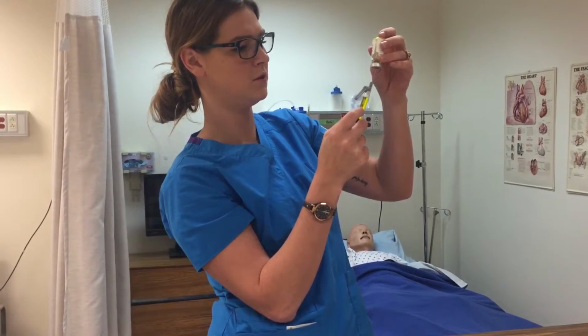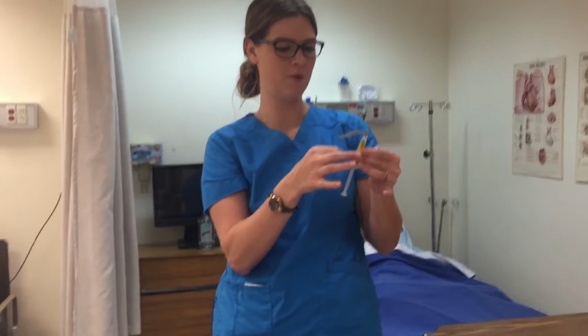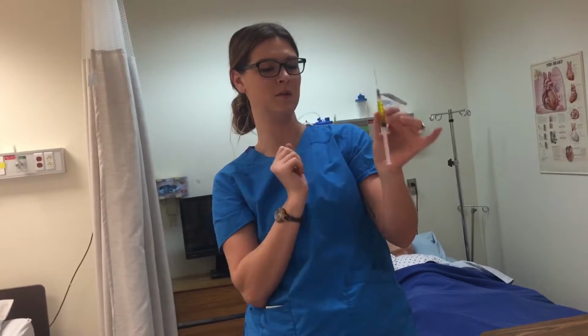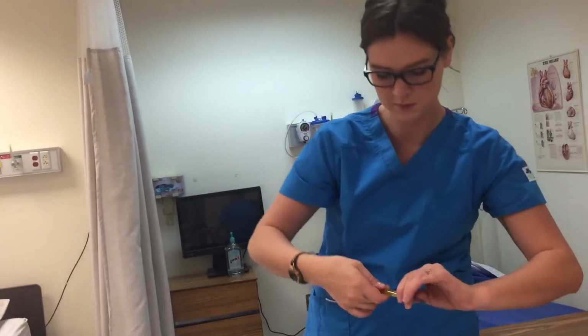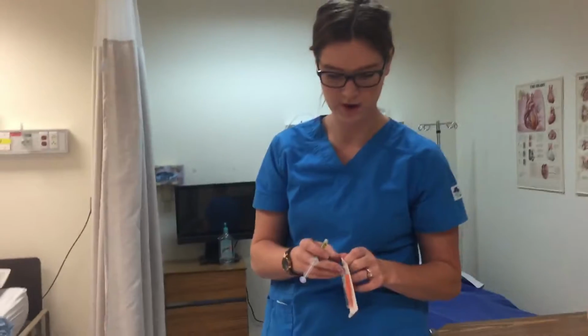Okay, so I dispose of this however the company wants me to take care of that. Get rid of the air bubbles. Air bubbles are up. Quite a bunch of airspace. Okay, I'm right at 3 mils, so that's perfect. And now I'm going to put the safety on this needle and dispose of this needle because it has been dulled from being punctured so many times with the rubber stopper that it would not be okay to put on my patient.